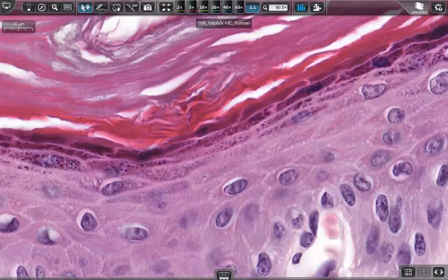And then here we have the granule accumulating cells. That's the stratum granulosum, representing keratohyalin granules. Over the stratum granulosum, there is a homogeneous red area. This is the first layer having no living cells. So just compressed dead cells are present here.